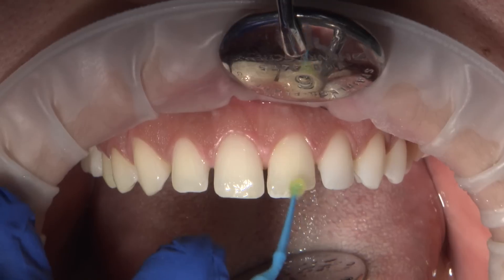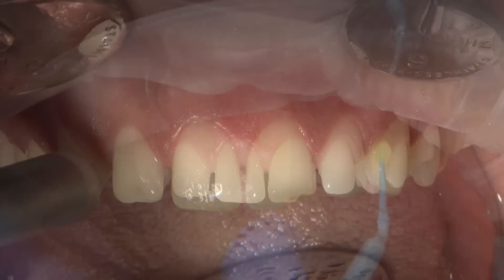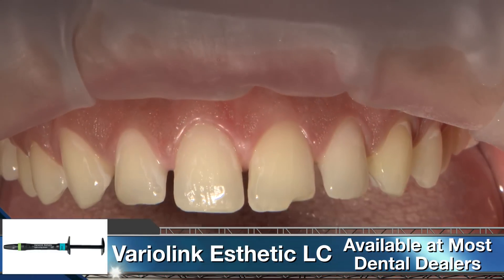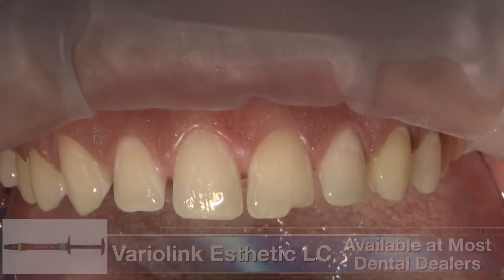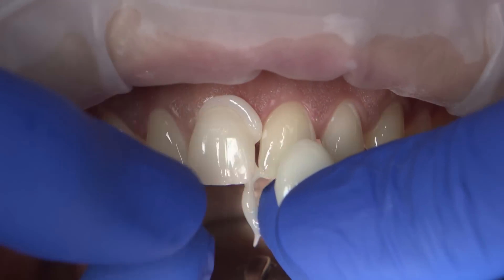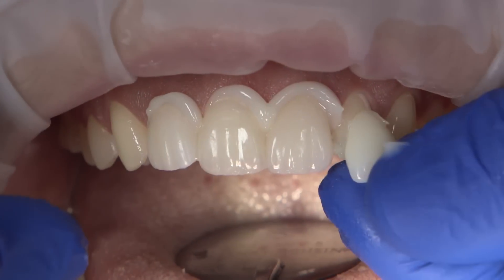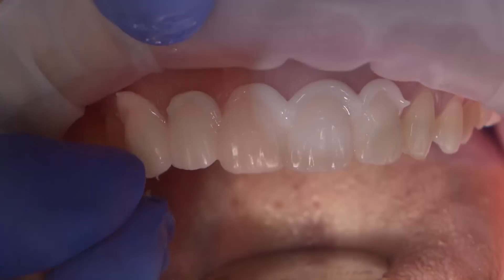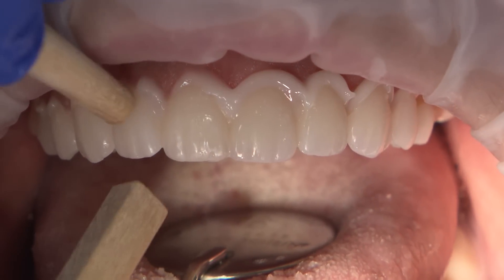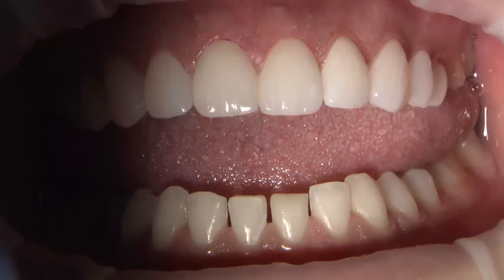Teeth were conditioned with adhesive after the application of the etch step. For this case, I chose Variolink Aesthetic luting composite for the final set, to ensure long-term color stability and ample seating time. The final no-prep veneers were seated sequentially with gentle finger pressure, starting at midline and moving distally towards the second bicuspids. To ensure all layers of the cement are polymerized, I final-cure each side for 20 seconds while applying pressure using wooden seating sticks.